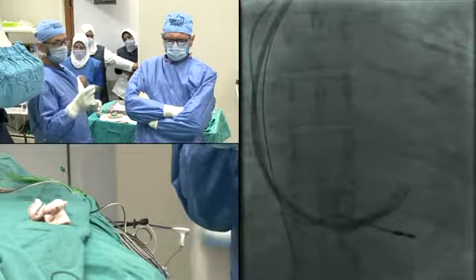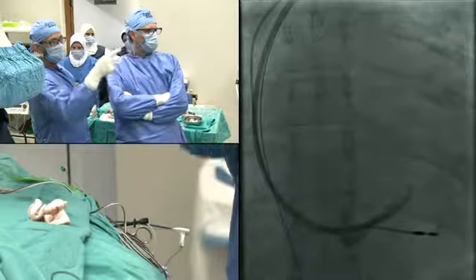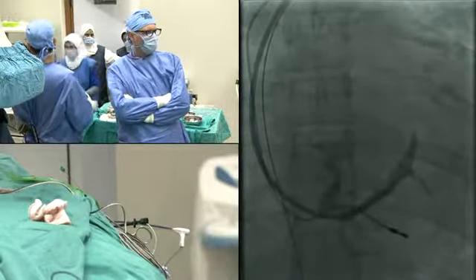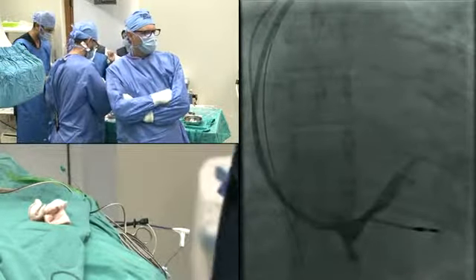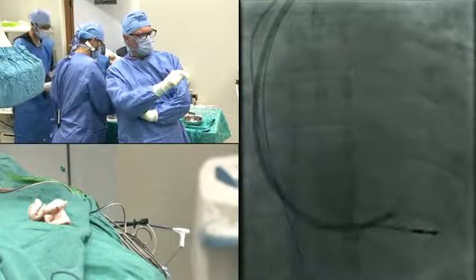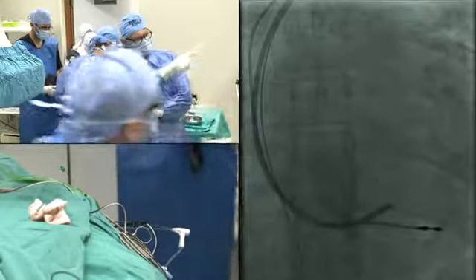Freeze, please, the angiogram. Freeze. CS lead. Going forward. A little more forward. You want to see that posterolateral branch?